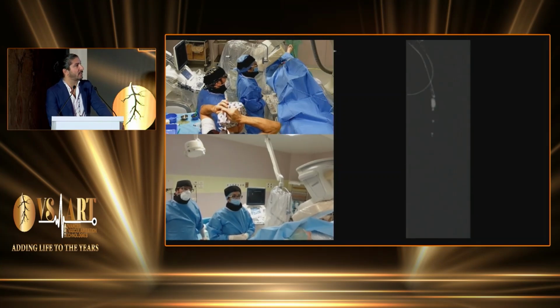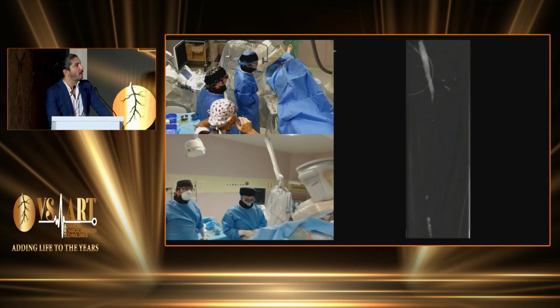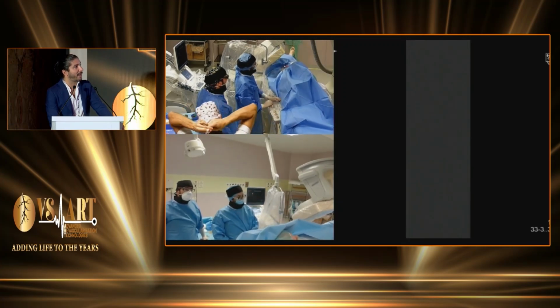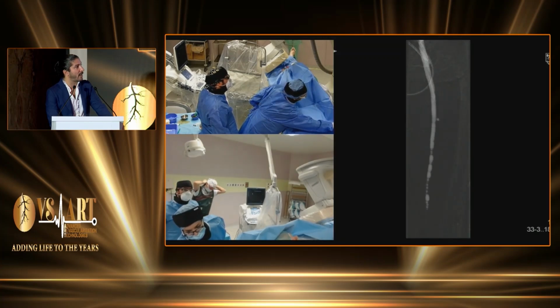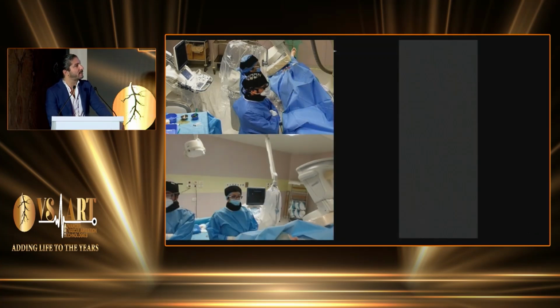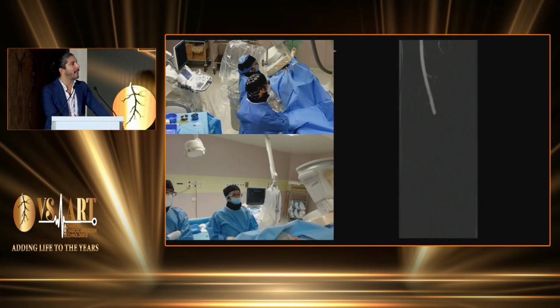Again, we start with an antegrade access in the common femoral, CO2 angio that shows a good femoral artery, very low flow in the femoral artery with CO2, but acceptable to have the diagnosis and to realize where the lesions were. So patent femoral artery. The same in the popliteal artery, so again, a pure below the knee and below the ankle case.